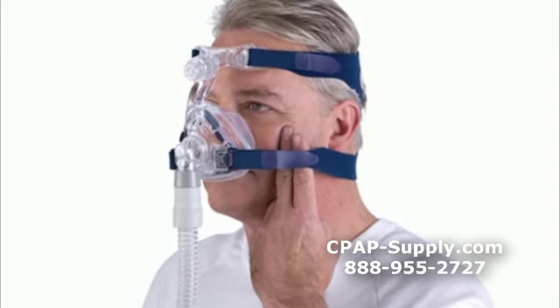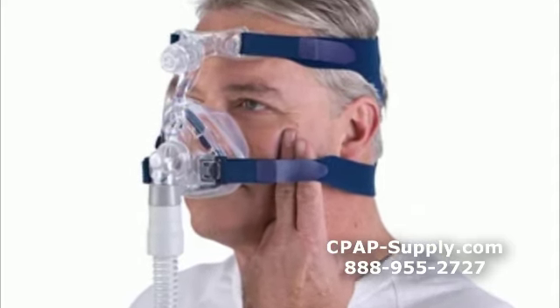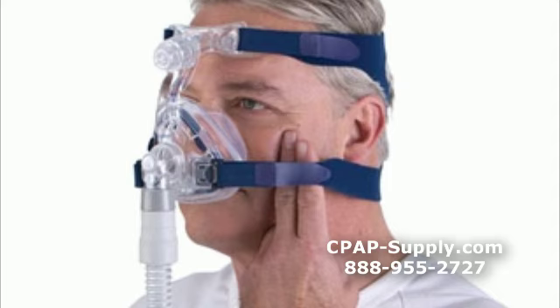This is the ResMed Mirage Activa LT nasal mask. This is a view of the mask in use. Let's look at the mask in more detail.